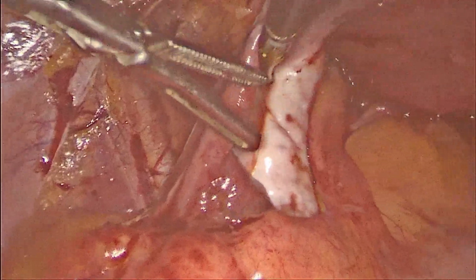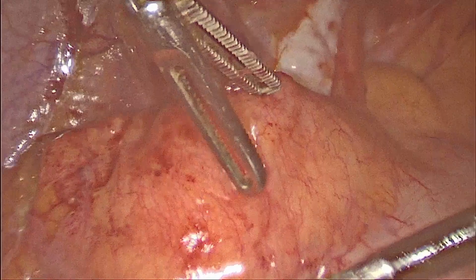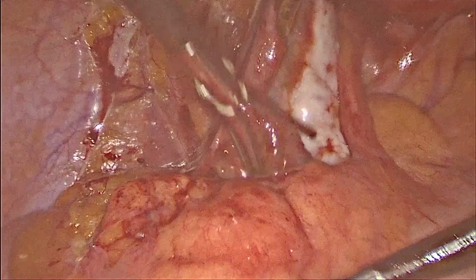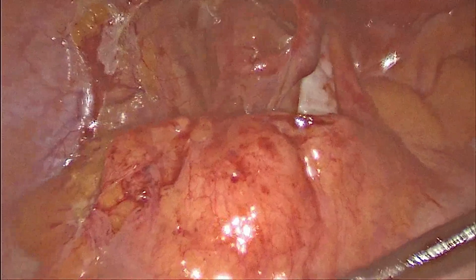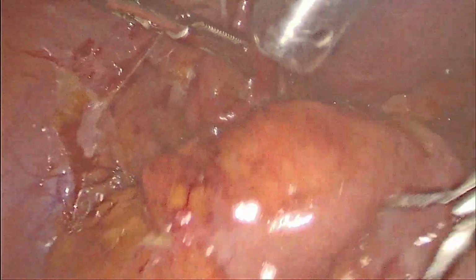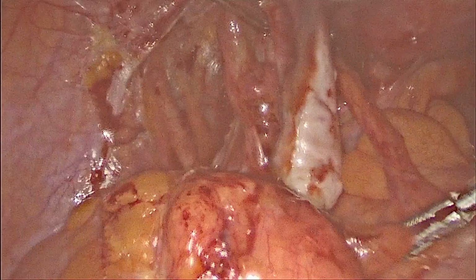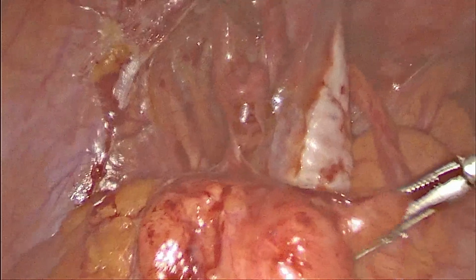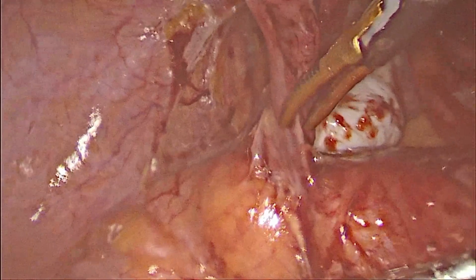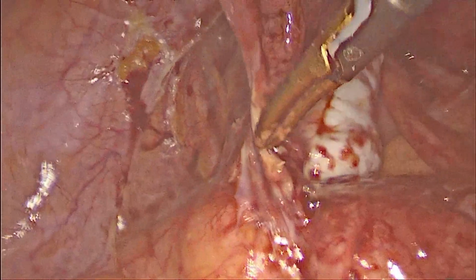So we can see that the fallopian tube and the ovary are stuck to the sigmoid colon. It is all because of the dense fibrosis and vascular adhesions between the two structures. So now we try to separate the sigmoid colon away from our surgical field and identify the infundibulopelvic ligament. Now we are exposing the mesosalpinx.